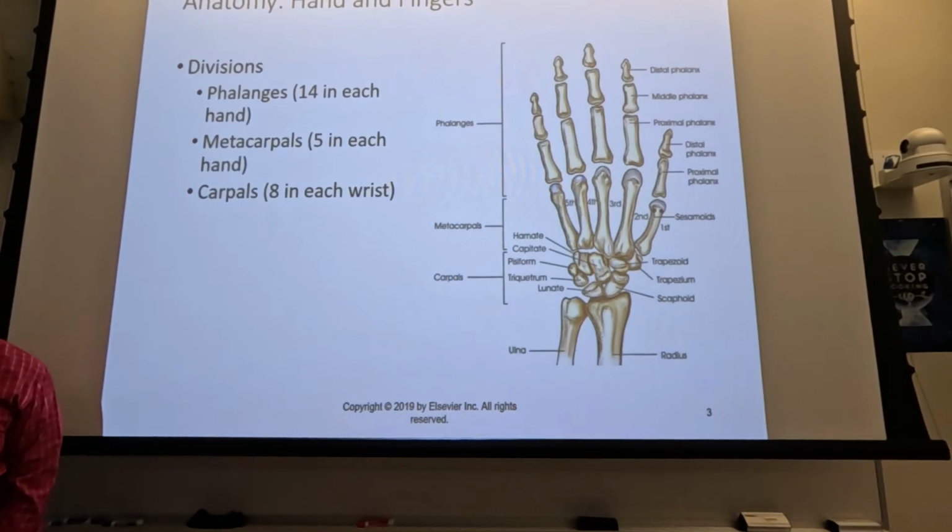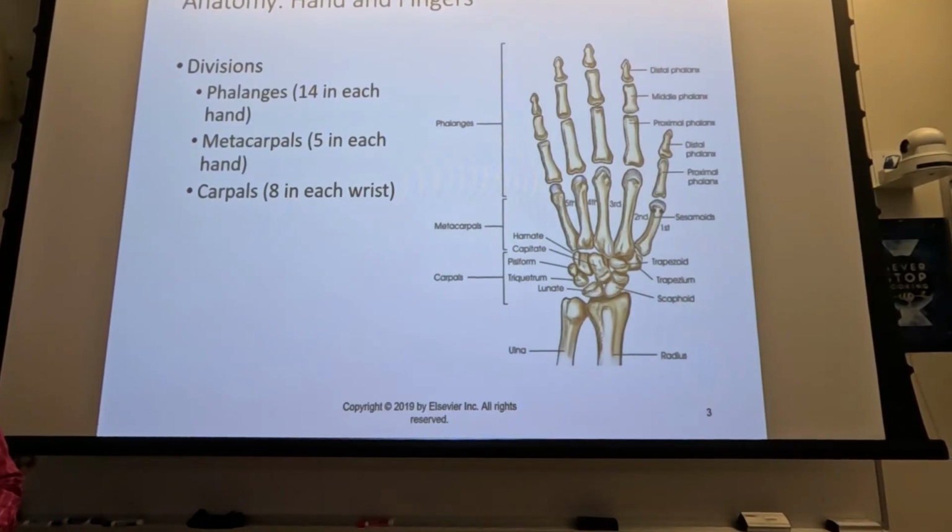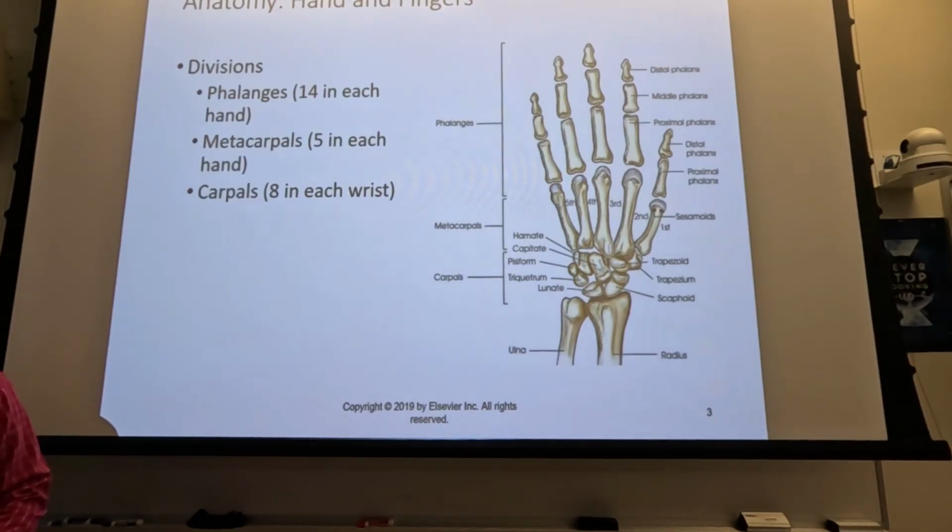So three things that you really don't have to spend a whole lot of time looking at in your Merrills and in your positioning is one, central ray location. It's going to be to the center of the anatomy that you're interested in seeing. Then you just got to identify where the center of the anatomy is, right? So that's number one. Number two is collimation is going to be to ½ inch beyond the skin lines. That's number two. Don't have to look at that.